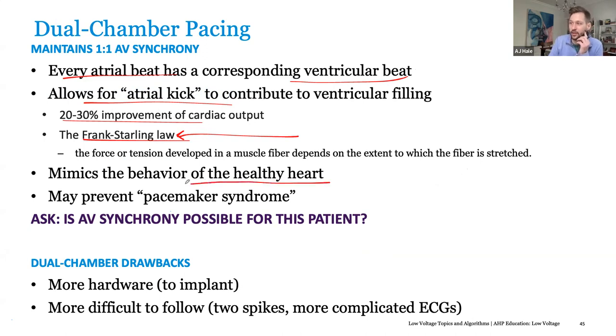You want to mimic the healthy heart as much as possible. So everything we're trying to do is to act like a healthy human heart, down to CRT. We're trying to be as close as we can to the intrinsic conduction system, because we haven't come up with a better system yet than what we naturally have. And then obviously we'll avoid pacemaker syndrome.